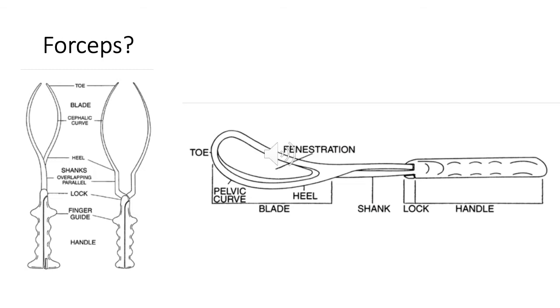It's important to understand the anatomy of the forceps so that safe and effective use can occur. These are two figures that I think are helpful in understanding all of the parts of the forceps. At the end of this presentation, there is a link to a 2-minute video that has a little bit more in-depth discussion of the anatomy of the forceps.